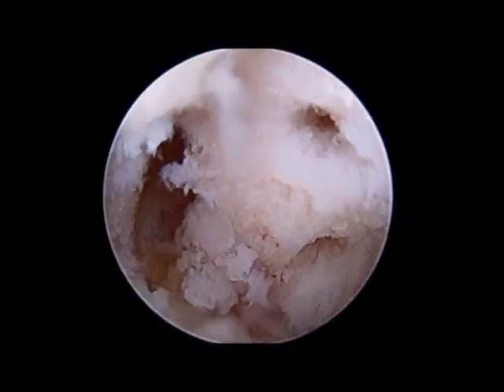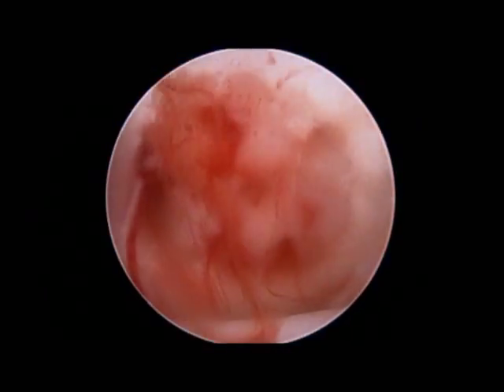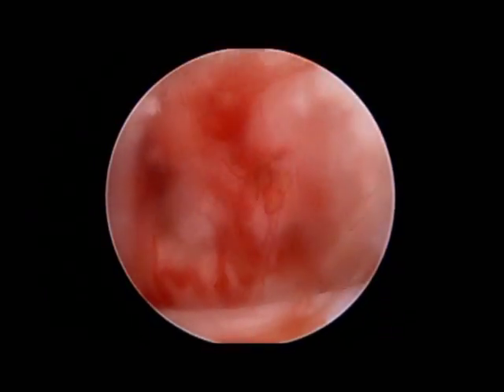That process typically takes about four to six months. When the tourniquet is let down, you can see blood coming in through these channels, indicating excellent blood supply and good potential for healing this lesion.